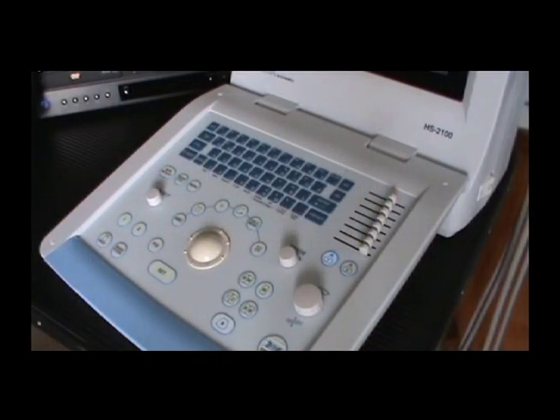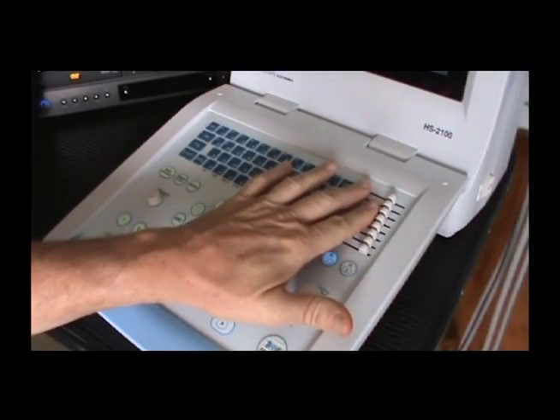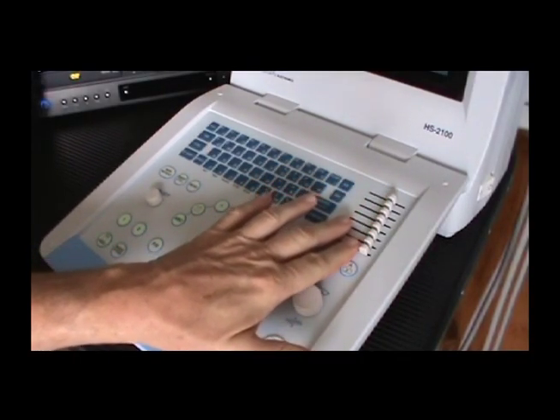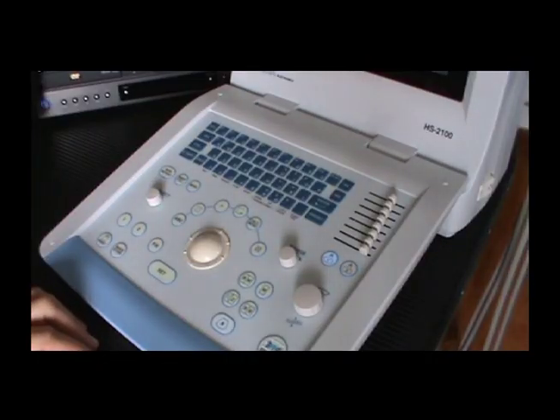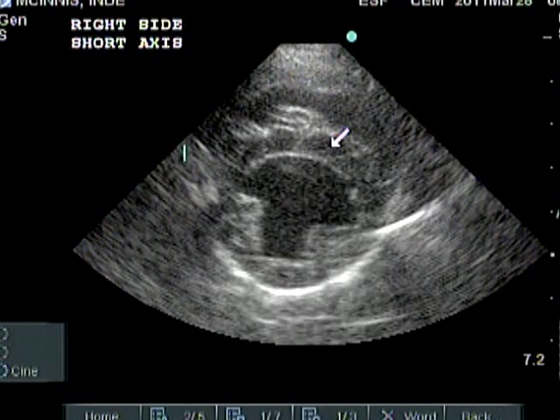In abdominal ultrasound, each TGC toggle is a little further to the right than the one above it for most organs. This is based on an assumption that tissue density and echogenicity will be the same from the top of the screen to the bottom of the screen. In cardiac ultrasound, echogenicity is not the same. Cardiac muscle is hypoechoic or dark. The endocardium is hyperechoic or bright white.